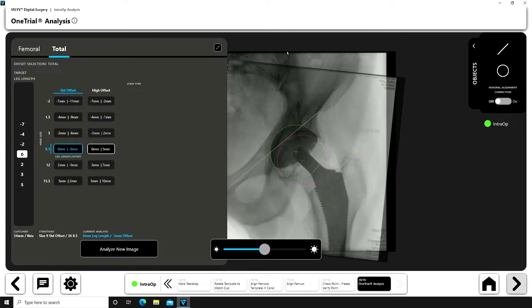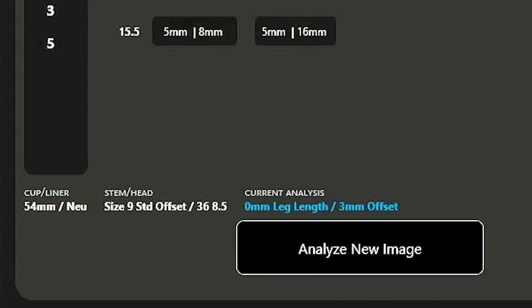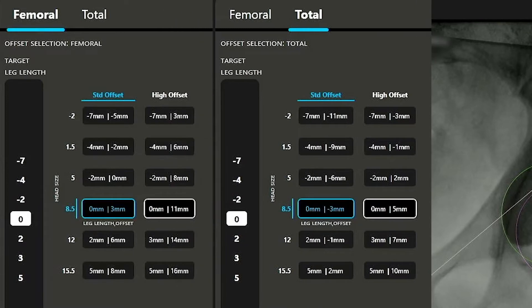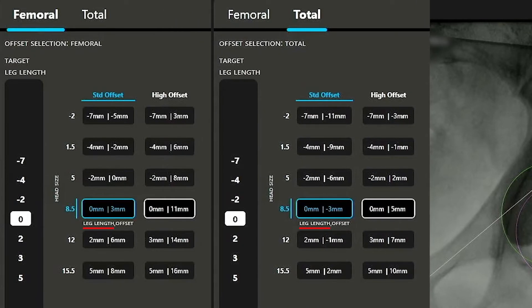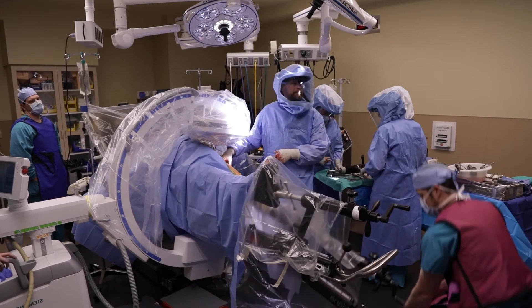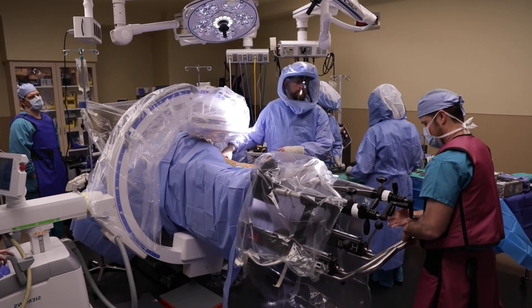The first one trial demonstrated here is done with the contralateral hip overlay technique using a size 9 standard offset stem and a plus 8.5 head. I'm trying to match the contralateral side, so I want the leg length to be zero. With the one trial numbers here, the patient's leg length is zero, the femoral offset is plus three, and the total offset is minus three. With a positive femoral offset, I know that this is a stable hip construct. I also perform an instability trial confirming that this combination is stable.